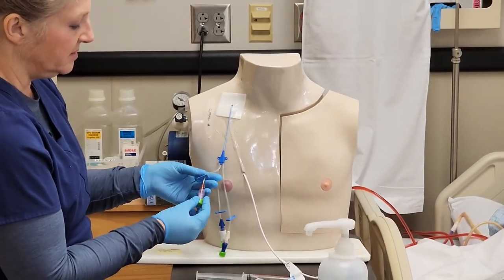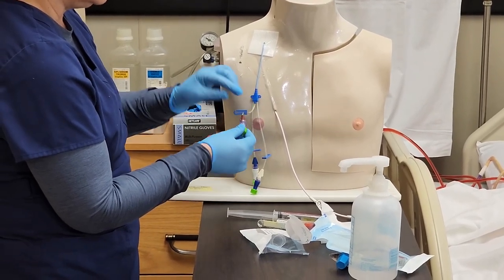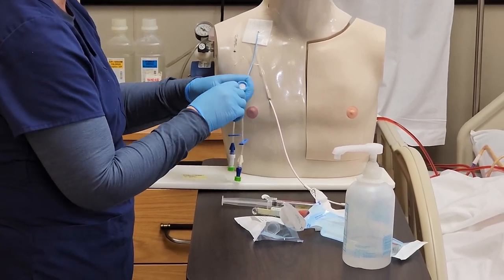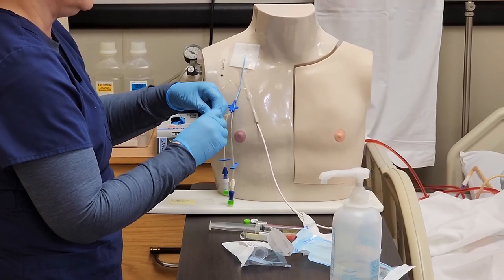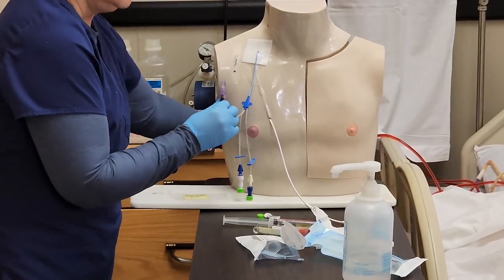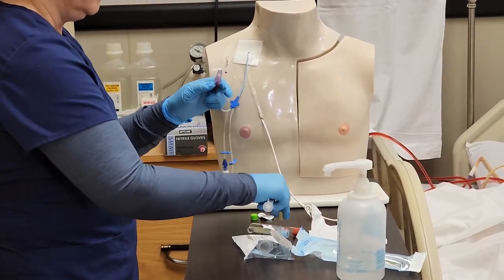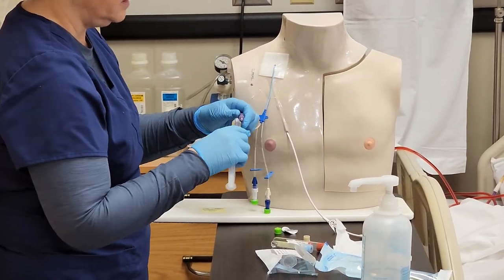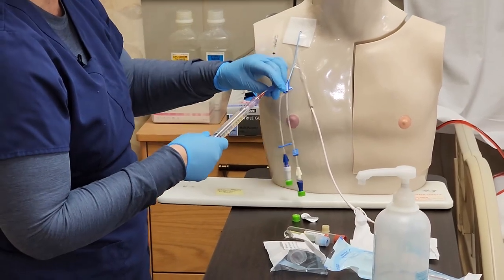Here we have our distal lumen. We have a needleless connector and the disinfectant cap in place, and the port is clamped. I need to take off my cap and do a vigorous scrub for at least five seconds. Then I attach my saline flush using non-touch sterile technique and open up my clamp, in order to confirm blood return and ensure this lumen is patent.